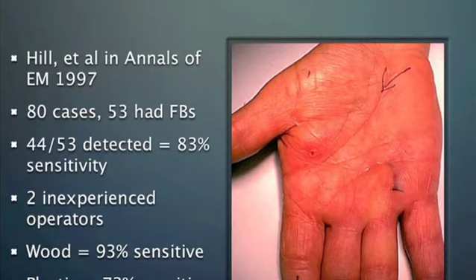And this was a case of a patient who came in who said they fell on an outstretched hand onto a toothpick, and this was the site of entry of the toothpick. And with ultrasound, the toothpick was actually located way over here. Before using ultrasound, if I was even able to see a toothpick on x-ray, I would have really been lured into opening up this area, searching around for a foreign body. However, the ultrasound is very successful in localizing it where it needed to be, which was where the toothpick wound up. This is what it looked like on ultrasound.